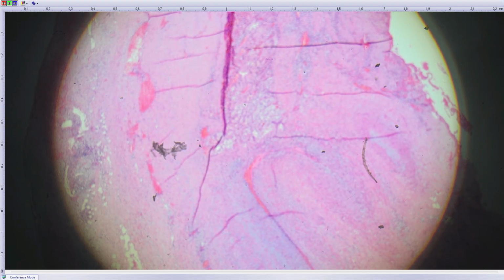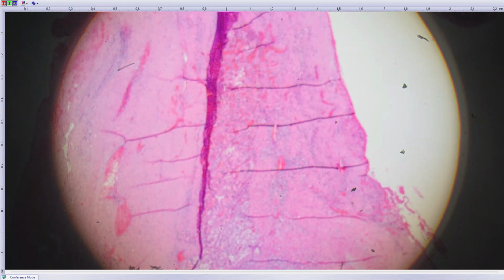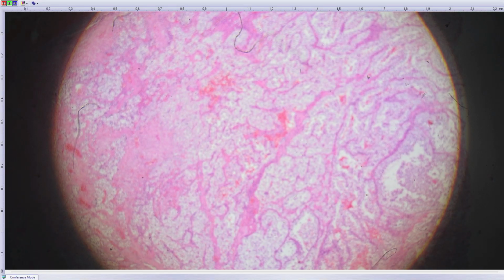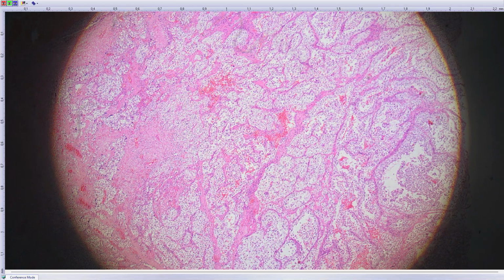I got a tumor which was localized somewhere in the pelvic area, so an intra-abdominal mass. It was sent to me because the original pathologist had some suggestion. It was in the neighborhood of the urinary bladder, but not connected with the urinary bladder.